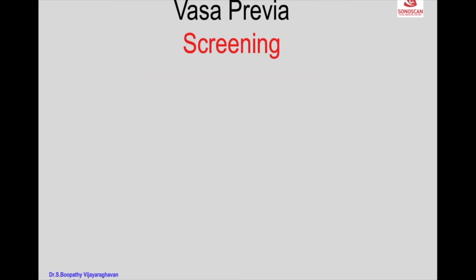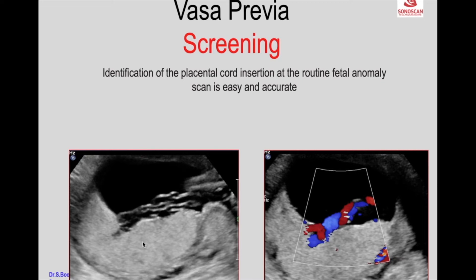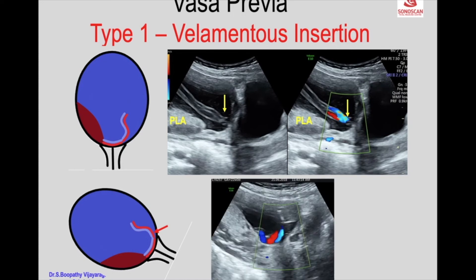Ultrasound has a screening role for vasa previa in the second trimester anomaly scan, because identification of the placental cord insertion is one of the requisites of that scan. It is easy and accurate. Once the cord insertion is identified, vasa previa can be ruled out. Here you see the velamentous insertion of the cord with the posterior placenta, the internal os, and the vessels crossing the internal os to reach the posterior placenta.